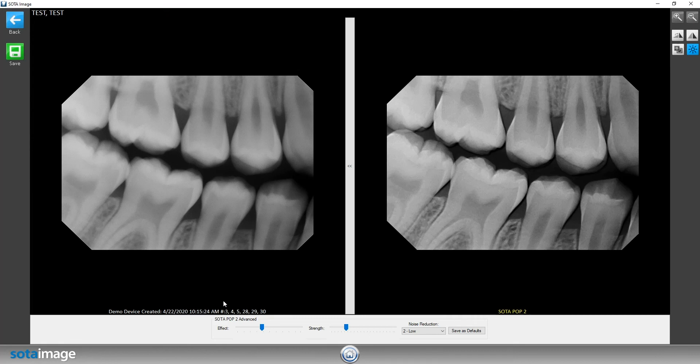From here, over on the left hand side you're going to see the raw image — the image that the sensor just spits out. Over on the right you're going to see the filtered image. Down below you have effect, strength, and noise reduction.